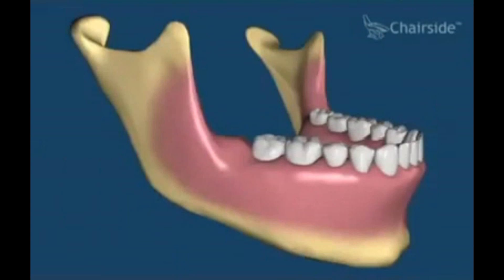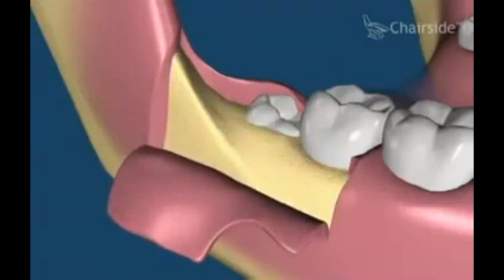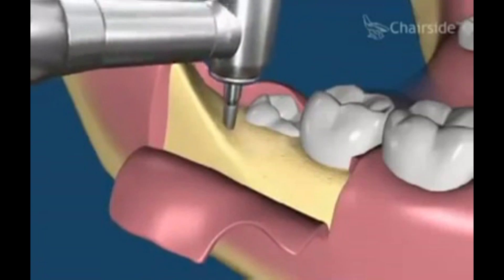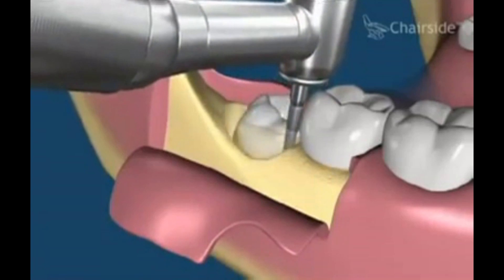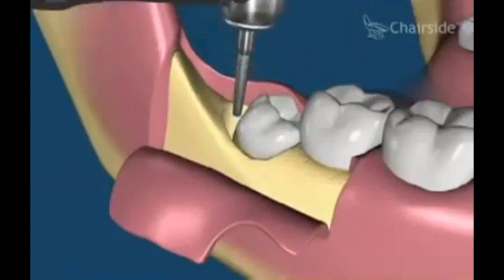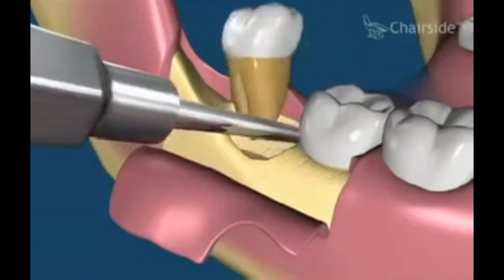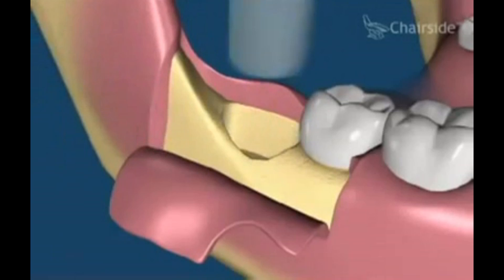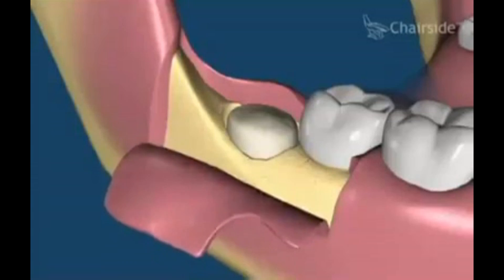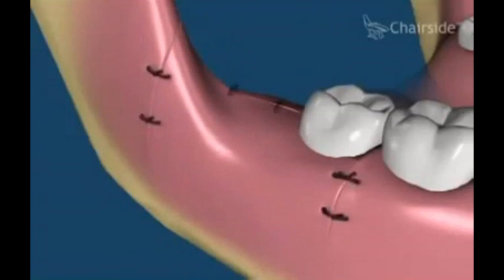This movie shows an impacted lower wisdom tooth in a partial bony removal situation. We first raise a flap, followed by some bone removal to gain access to the tooth. The tooth can then be removed with elevators. A bone substitute can be placed in the socket to aid in healing. The flap is repositioned and sutured into place. The sutures dissolve and the area heals.